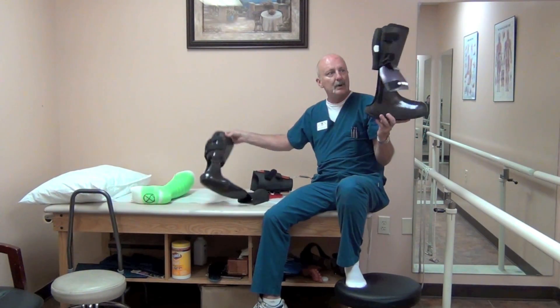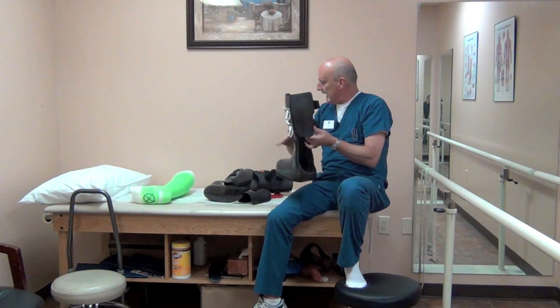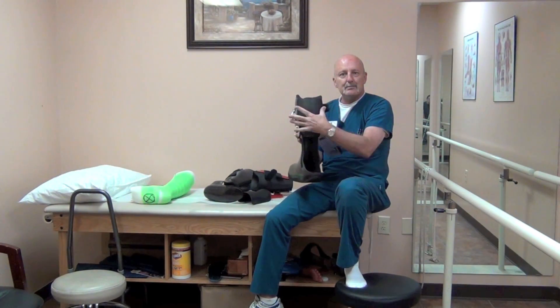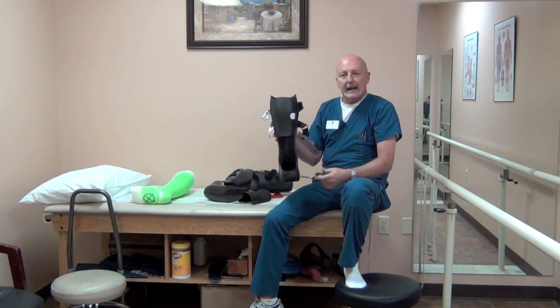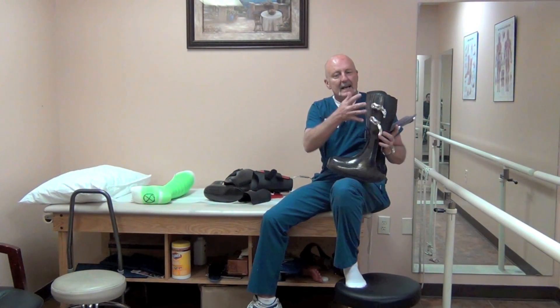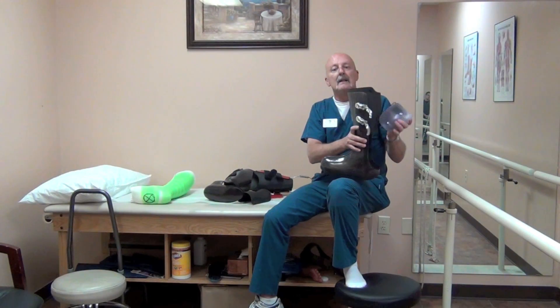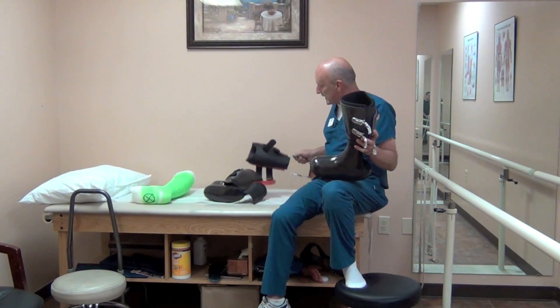Basically, all the same premises apply — the friction. We offer them with both ski buckles and Velcro closures. Ski buckles give better leverage and offer a little bit better control, and this is the design we're leaning toward in the future. The Velcro does work, as I will show you.